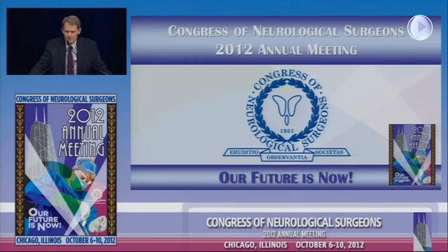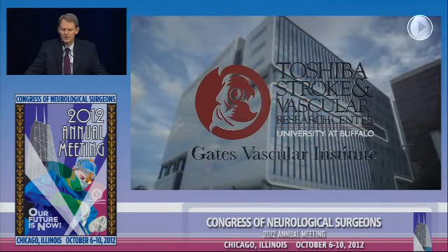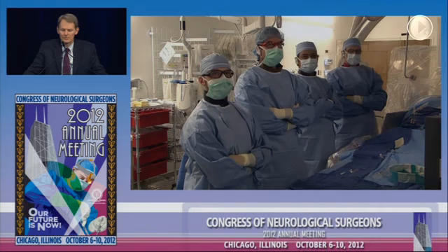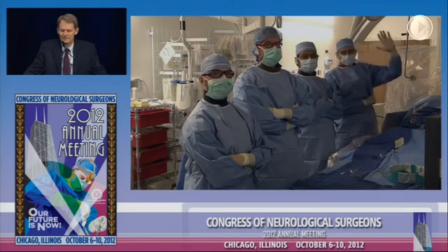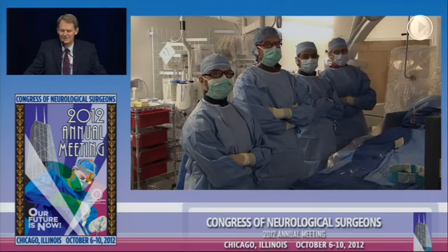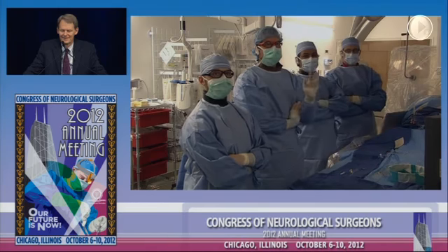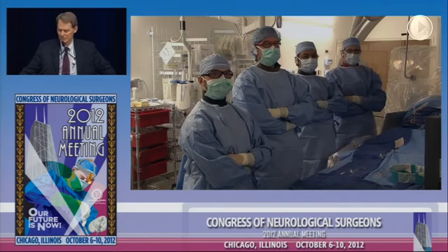Thanks. So this is an opportunity to talk about some really nice new technology. In the group standing at the table, let me introduce everybody. At the head of the table, Elad Levy. Next to Elad, Adnan Siddiqui. Next? Travis? Good morning. Travis Dumont and Grant Sorkin. So our team in Buffalo is going to do this case.